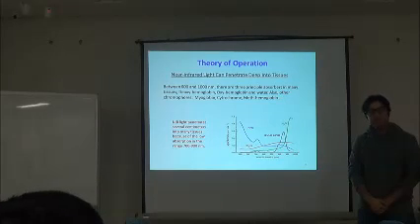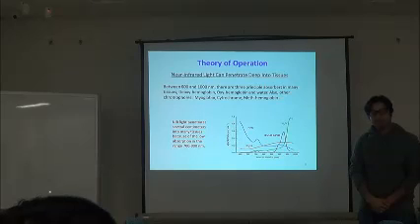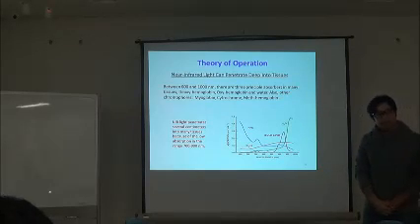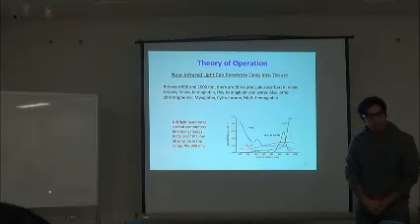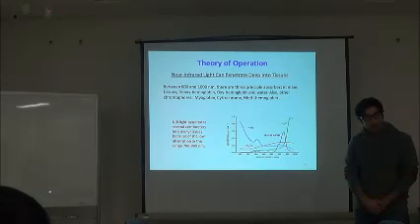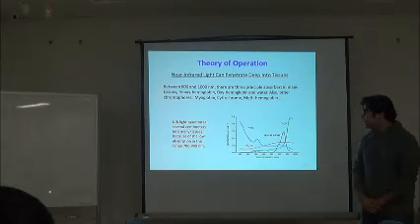Are there some differences in the absorption between large vessels or small vessels in this case? If someone has large vessels in his or her brain, and small vessels in your brain.